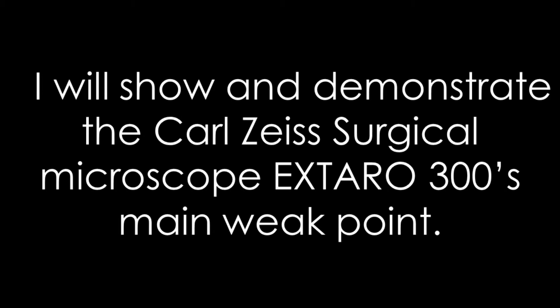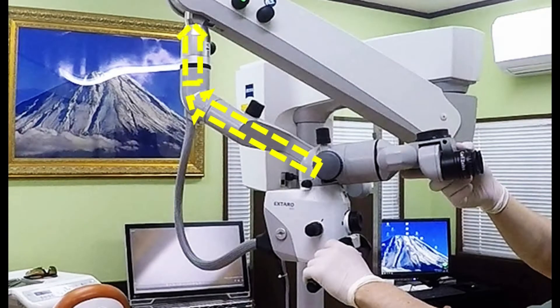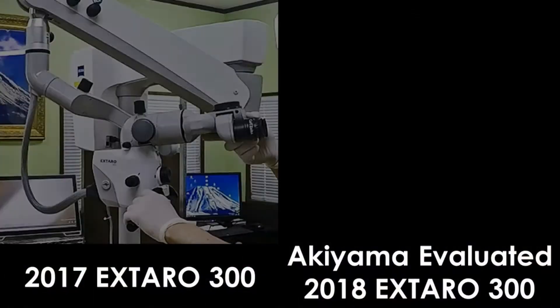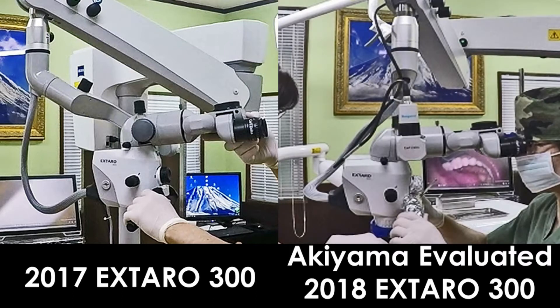I will show and demonstrate the Carl Zeiss Sojiko Microscope Extra 300's main weak point. I will show you how difficult it is to turn the Extra 300. This is due to the microscope being attached to an arm that isn't vertical, therefore not allowing for the microscope to move independently.